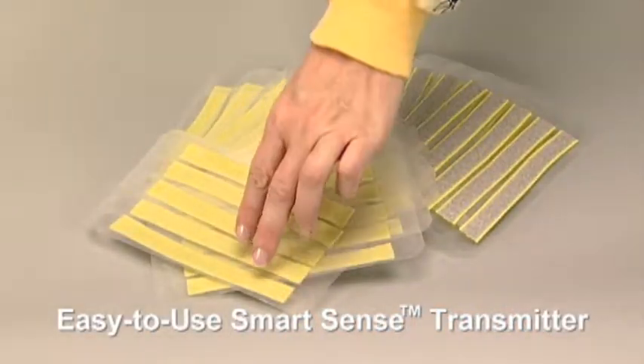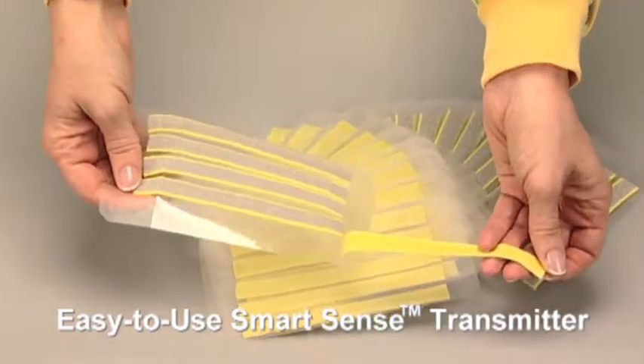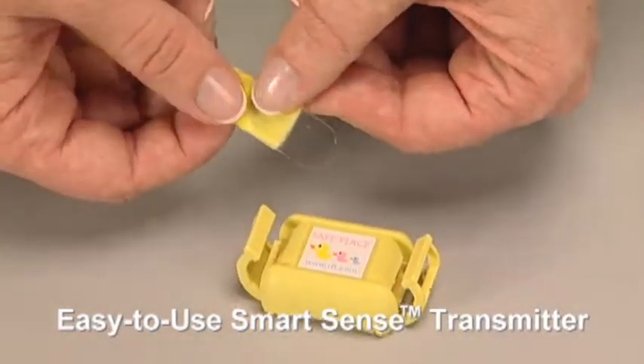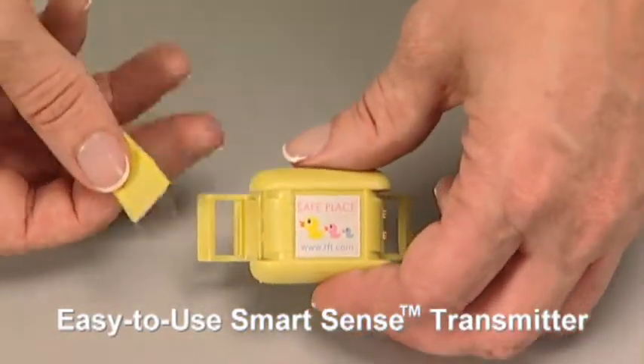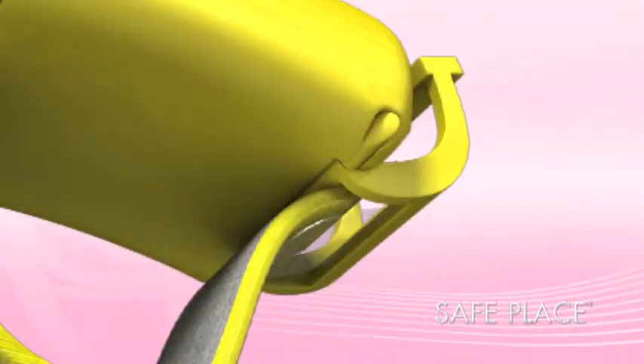First, remove the SmartSense banding material with plastic guide tabs attached from the backing. With the yellow side facing outwards, use the plastic guide tabs to thread the banding material through the lower slot of the transmitter clamp.